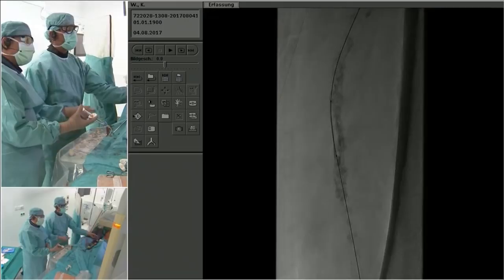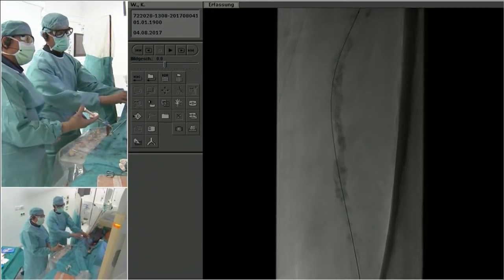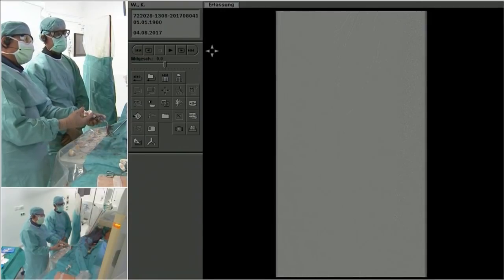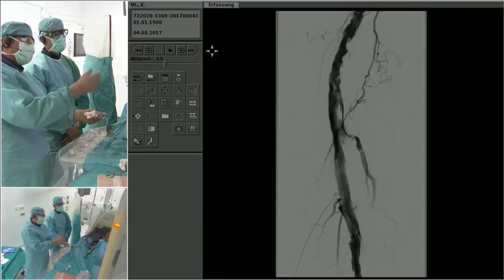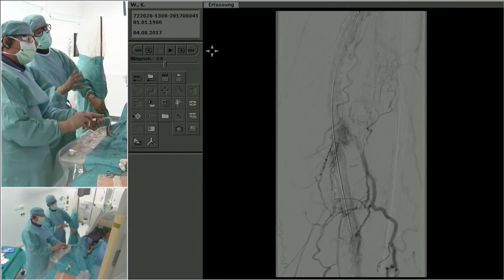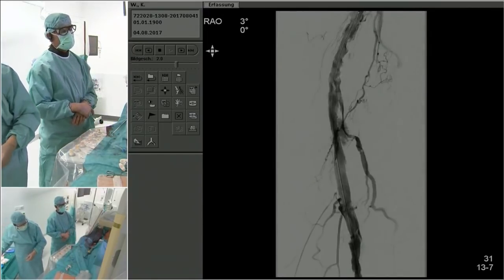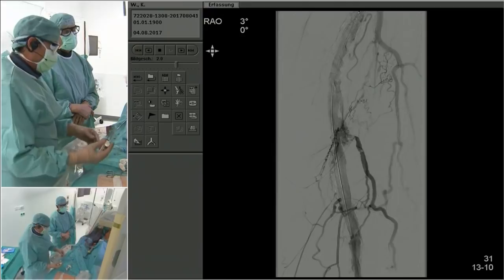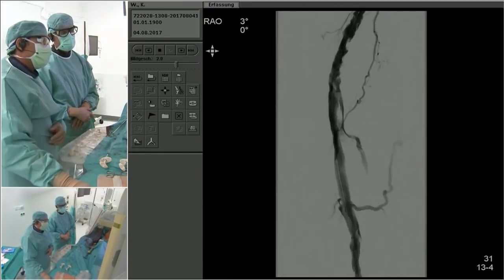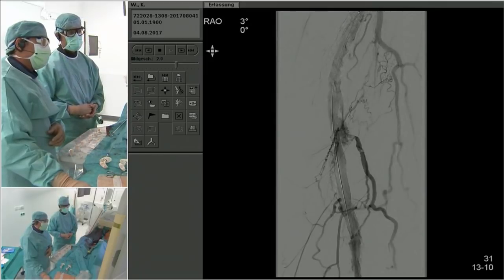Andrej, I have a question. Is the patient completely pain-free? Absolutely pain-free with this local anesthesia around the plug here. Excellent. So time for Viabahn. There's a little bit of perforation. This is actually not really of big concern for me here now. Although at the end, we actually don't know what the future of that is. Will a pseudoaneurysm occur with this here?